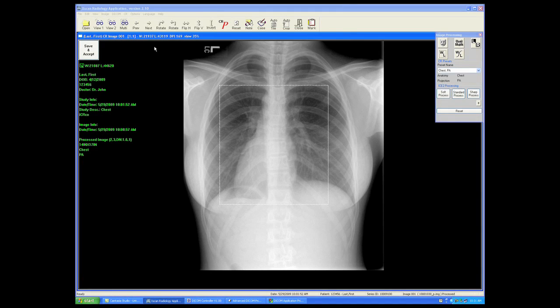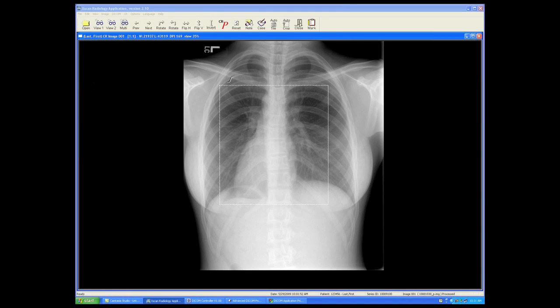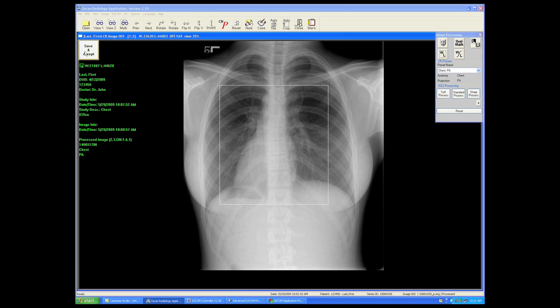That's how we window and level, or adjust the brightness and contrast of the image before sending it off to the physician to be reviewed. The save and accept button will lock in the window and level that we have assigned to the image prior to a DICOM send. All images must be saved and accepted before sending them to the review station.